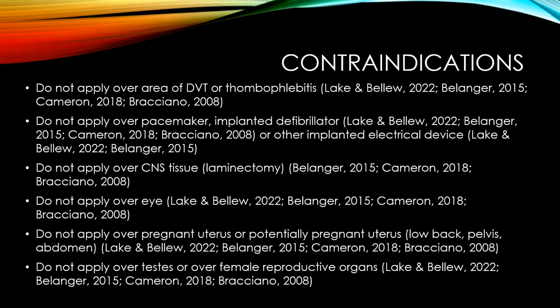So in that case, you would avoid over the low back, pelvis, abdomen. And just a word about a potentially pregnant uterus, you really would need to ask your client, is there any chance that you might be pregnant? Do not apply over the testes or female reproductive organs. And that concludes the contraindications for therapeutic ultrasound.